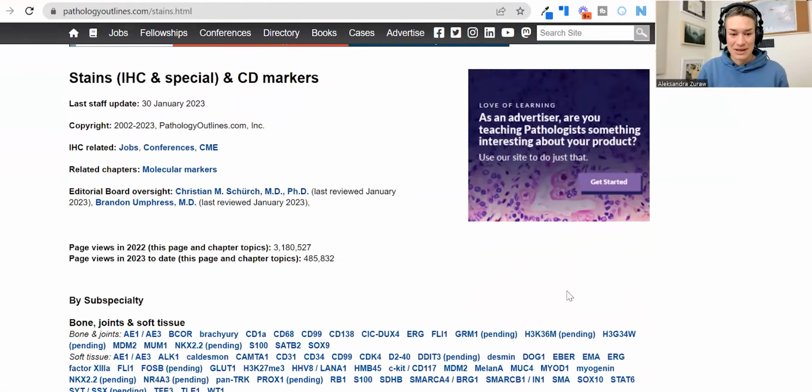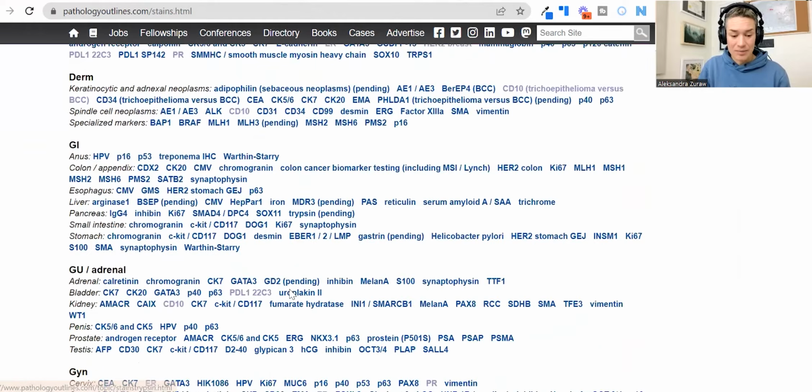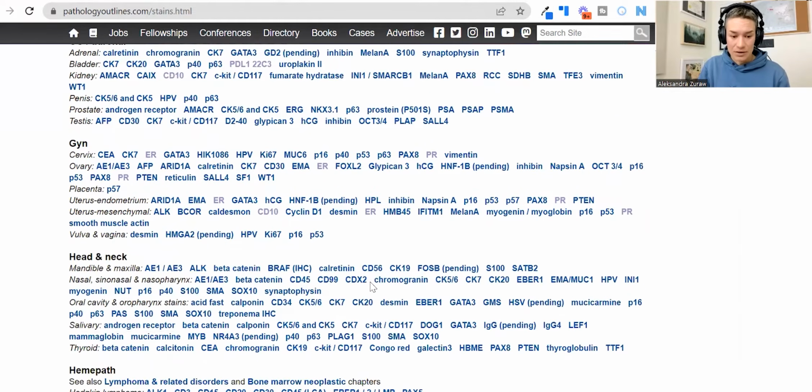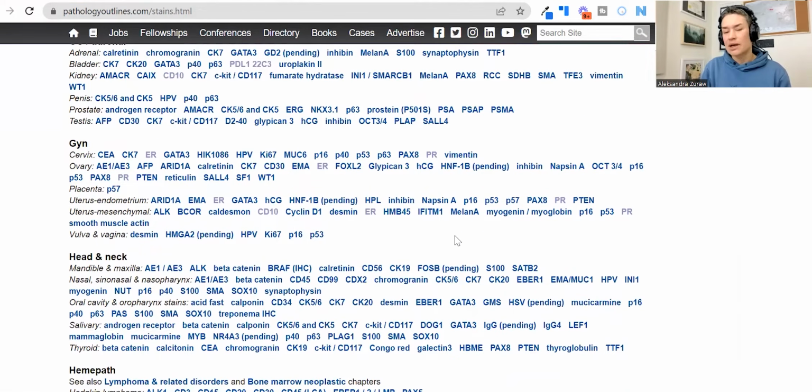So when I was working as a 100% digital pathologist at the tissue image analysis company where I was working, we would always get those different markers from different pharma companies that they were doing some exploratory work. I was like, oh, I have no idea what these markers are. Don't worry, you don't have to have an idea, and they come up with different markers. So if you have never heard of this protein, you go to this page, stains, in this blog post, and you can find every freaking stain on the planet that is being used for diagnostics and often for research as well. But you were asking at some point, oh, how do I know if it should be expressed in the membrane, in the cytoplasm, in the nucleus? Here, you're gonna see it.